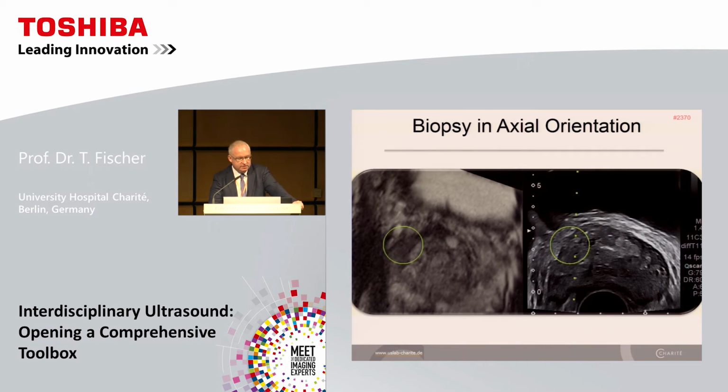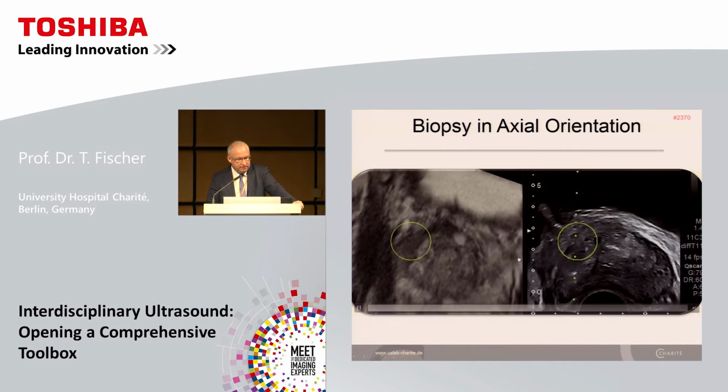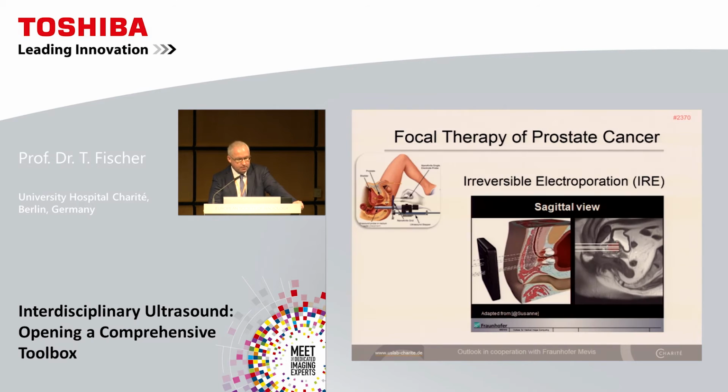And last but not least, of course, you have to do a puncture analysis, once again done by fusion biopsy. And look at the beauty of imaging. We see here the mass and clearly also in ultrasound, and so you can pick up easily your anterior lesion. This is a new approach in our center.